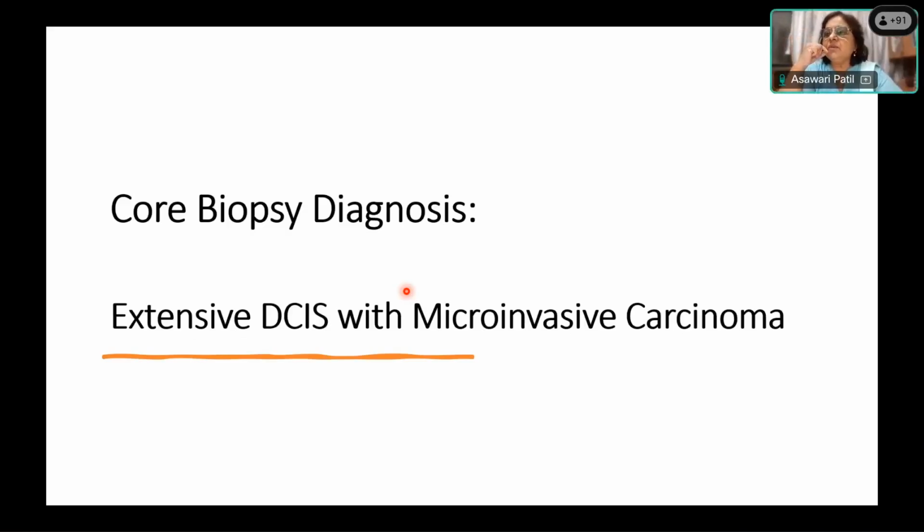What about clinicians? Are they going to change any treatment if I call DCIS on core biopsy versus invasive carcinoma? If I miss any, or if the biopsy doesn't include any invasive carcinoma, will there be any change in treatment? And what is the treatment, by the way? Mastectomy. Invasive, it's not always mastectomy. I would say excision with wide local excision or mastectomy. So is it for invasive? For DCIS, they don't do anything? Any DCIS they will do lumpectomy.